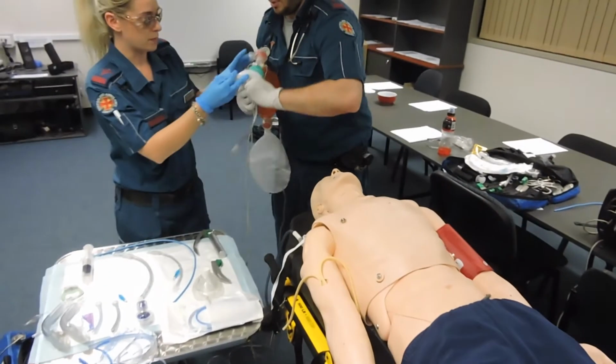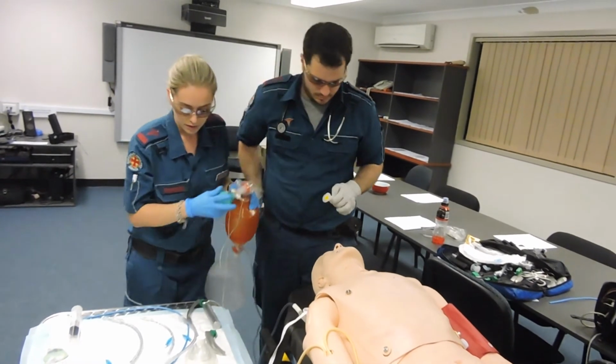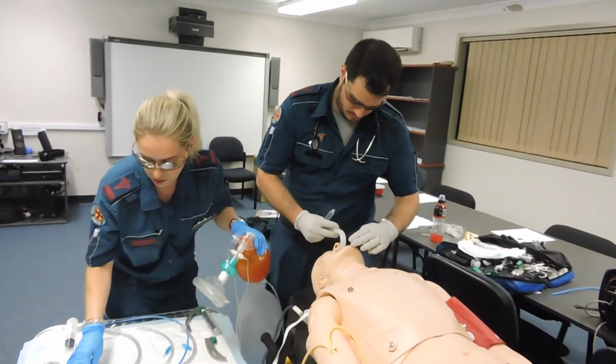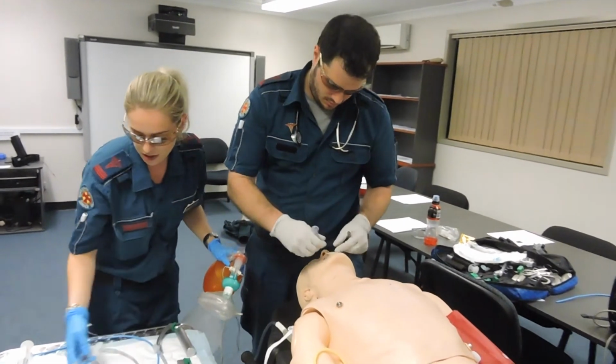Then what I want you to do is pop an OP in for me. Yep. I'm going to pass you 2 nasos. They're already lubed up. I want you to pop those nasos in for me. Sure. And then I'm going to step in behind you.